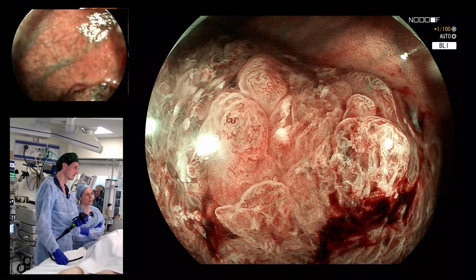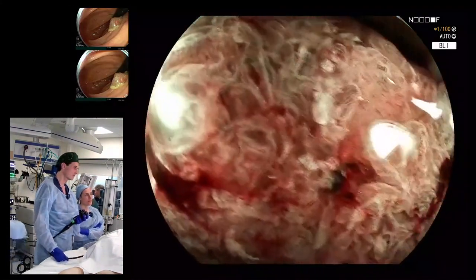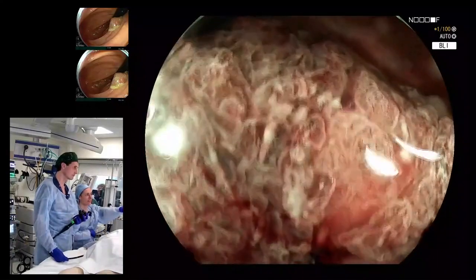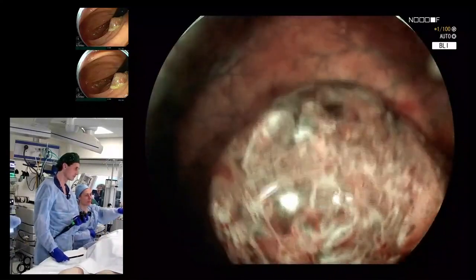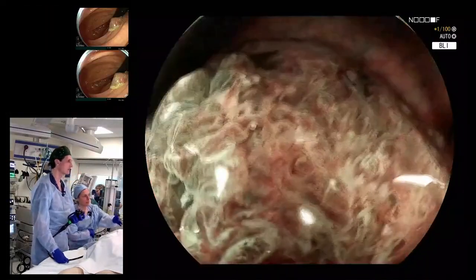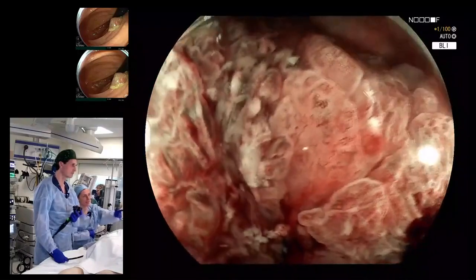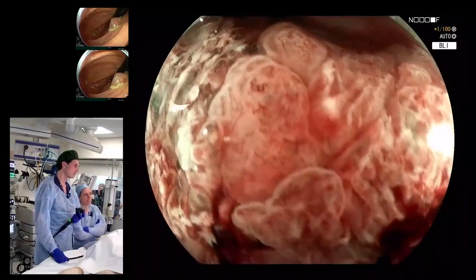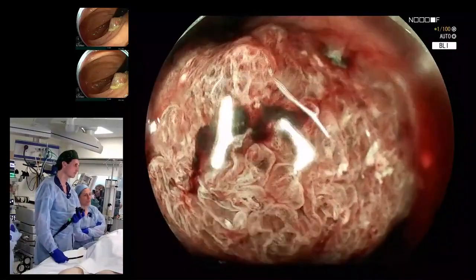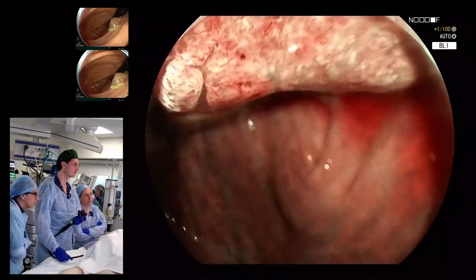I agree. So, but just for clarity, we're used to seeing what's now on the left, and the left of that we would describe definitely as completely regular. People might question, go to the right, please. Might question, what about these vessels here? They're a bit dilated, they're a bit irregular, but you often see them like this, I find. I don't know, David, if you want to comment on that, but I don't think they're worrisome.